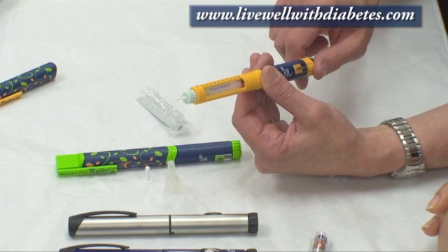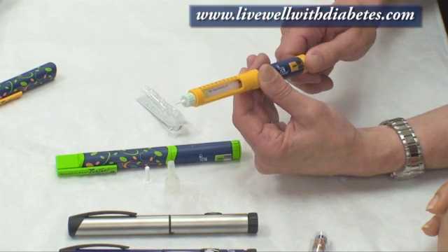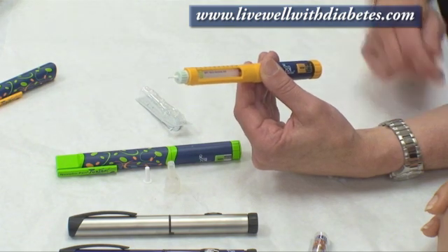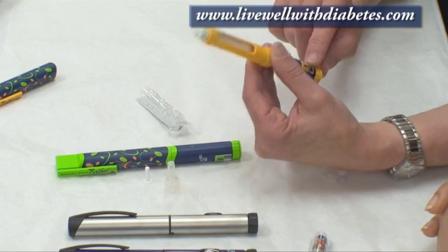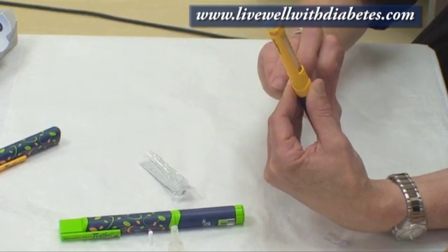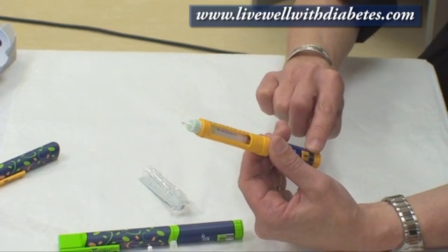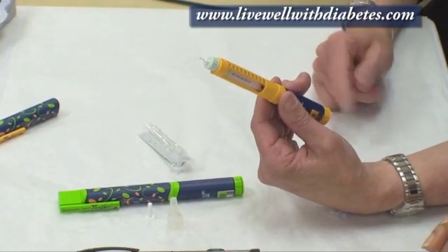To turn the dial, hold onto the orange end and turn it to number four — one, two, three, four. It's a junior pen, so every half unit it makes a click. When you're at number four, point the needle up to the ceiling and push the button on the end. You want to see a drop of insulin come out. When you push it in all the way, the dial will go back to zero. If you didn't see any insulin come out, redo that step.